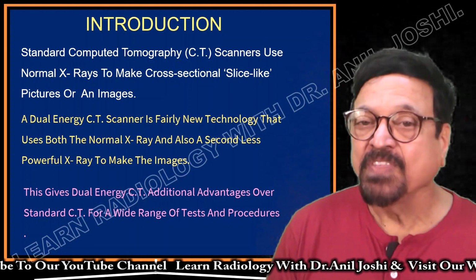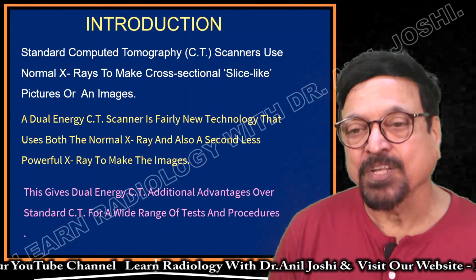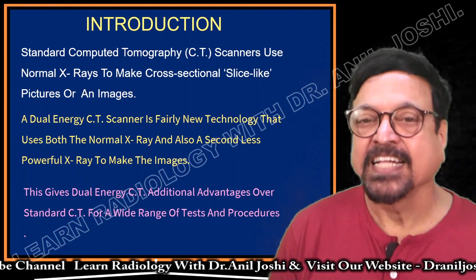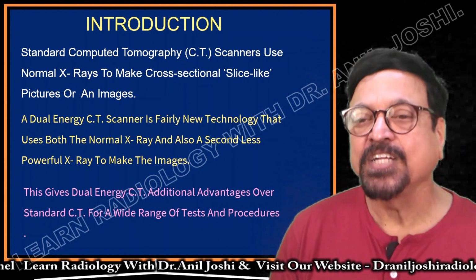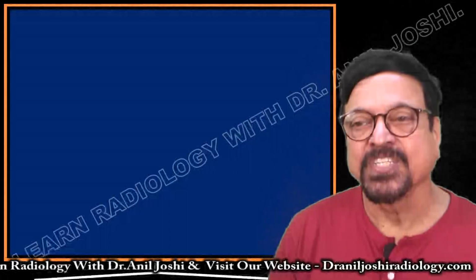We are going to see how these two tubes along with two sets of detectors work. This gives the dual energy CT scanner an additional advantage, because it scans at two different energies, an advantage over the standard CT scan for a wide range of tests and procedures.